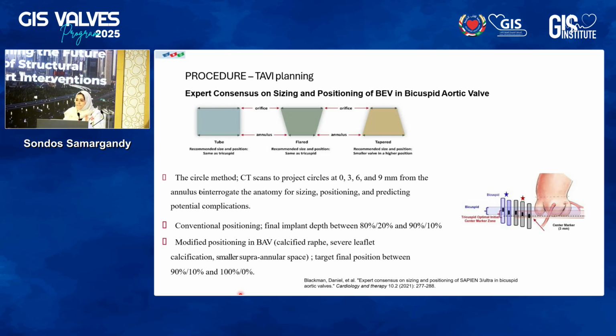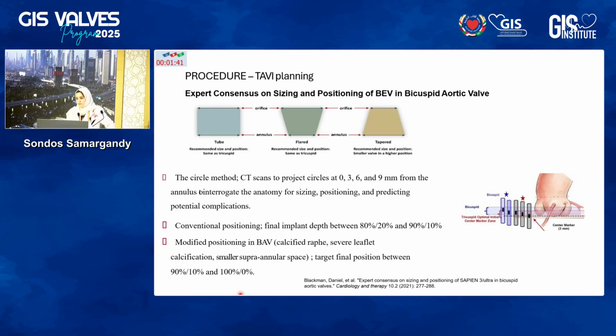Well, the data, basically, when we talk about bicuspid aortic valve, there is no preference of self-expandable valve versus balloon expandable valve. But usually we use the same techniques when we talk about self-expandable valve. However, we try to use more pacing sometimes in these cases, and we ensure the wire position usually more toward the LV to ensure the valve is aligned to the annular level.